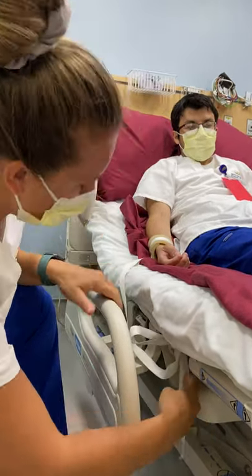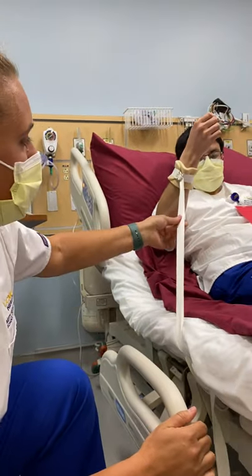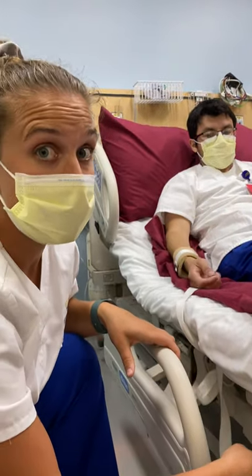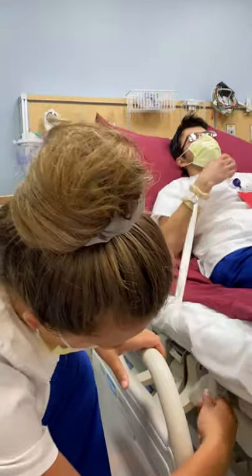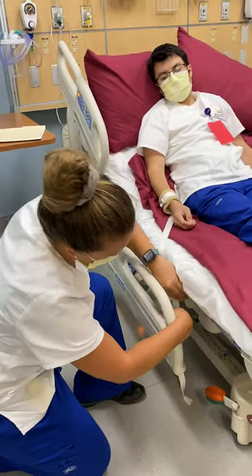So what's going to happen is — Fabian, can you move your arm? So it keeps him from being able to pull out tubes or do anything dangerous to himself or someone else, but it can be released really quickly when you just undo that and then you can take it off.